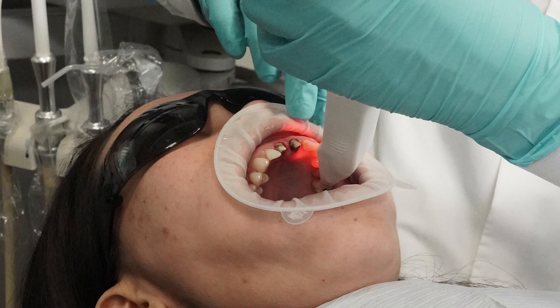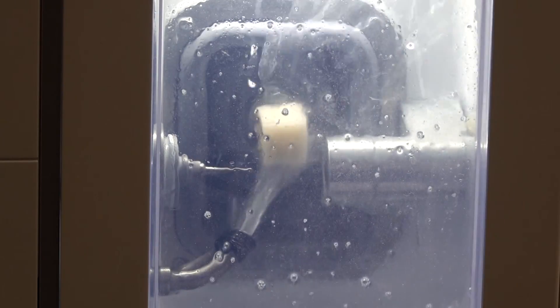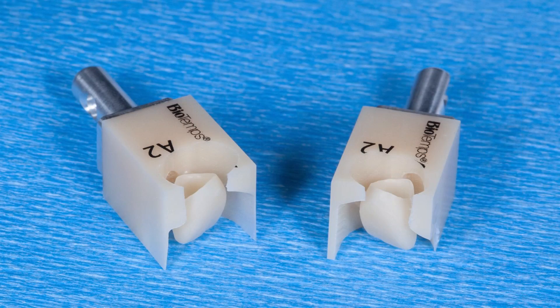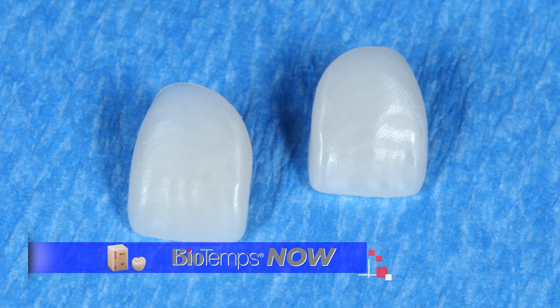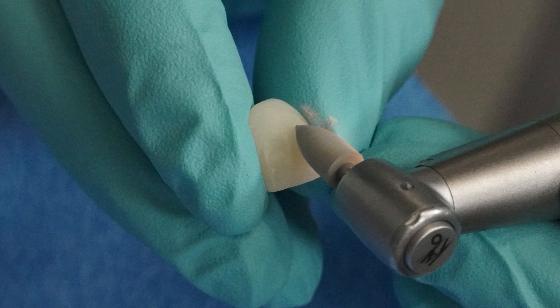She's taking the case through the Glidewell.io in-office solution to fabricate Biotemps Now provisional restorations. Biotemps are a long-lasting PMMA acrylic material that mills out very quickly, with each restoration milling out in less than 10 minutes. This is the quickest way to get a perfect fitting restoration in a very short amount of time. Once the restorations are milled out, you can achieve a very nice finish using a chair-side composite polishing system. Dr. Manalili uses the Venus Super Polishing Kit to achieve a nice smooth surface and great luster on these provisional restorations.